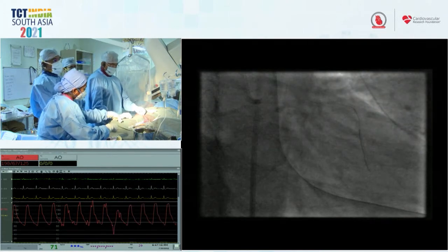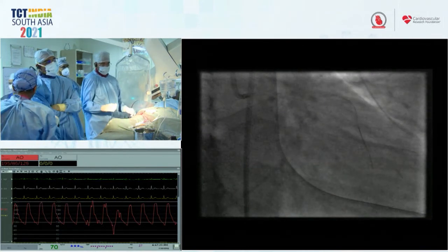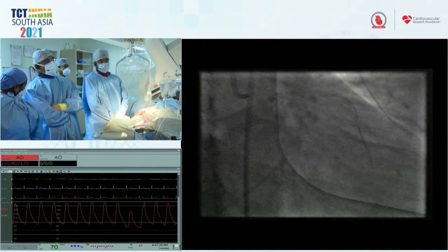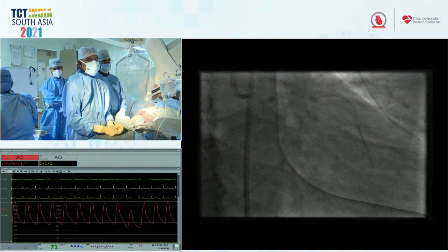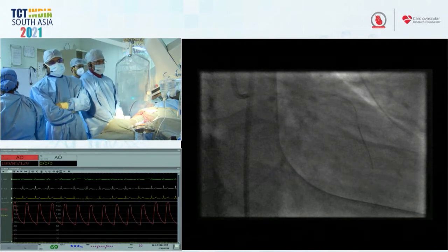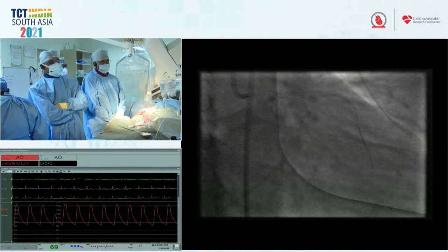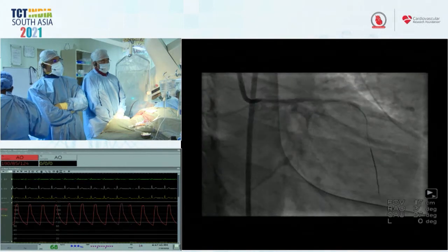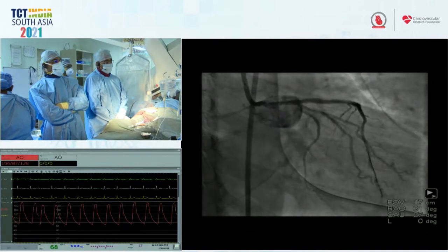So I'm going to be the odd man out here and say that I would probably connect the stents in the left main, especially if the OCT gave me a 12 or 15 millimeter length that I could come out into the ostium by a millimeter or two. I would actually not double jail the circ. My rationale is if you have stent boost and angiographic co-registration, you only need a millimeter or 2 of overlap. Your OCT showed you have at least 2 millimeters going over the circumflex.